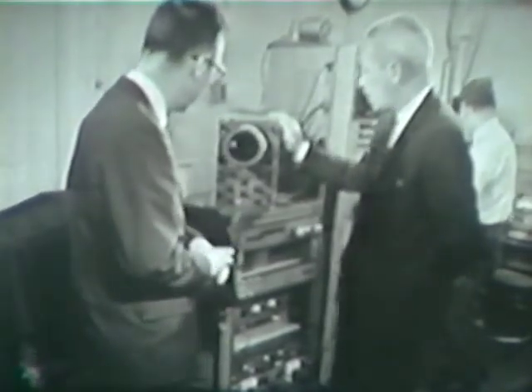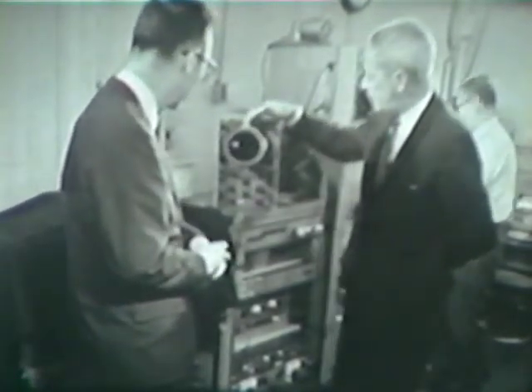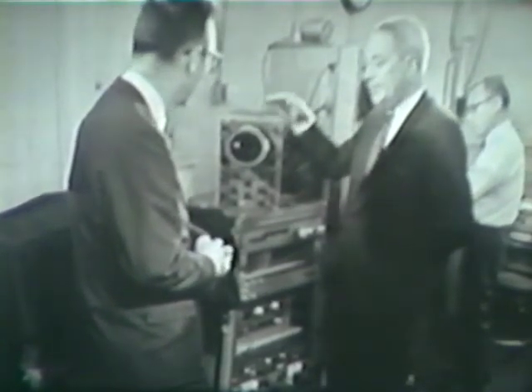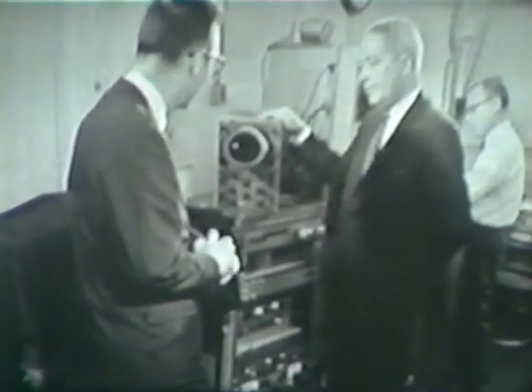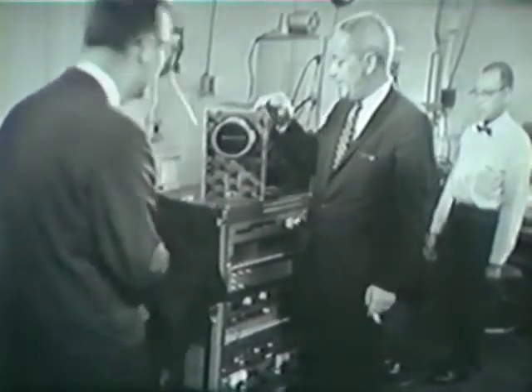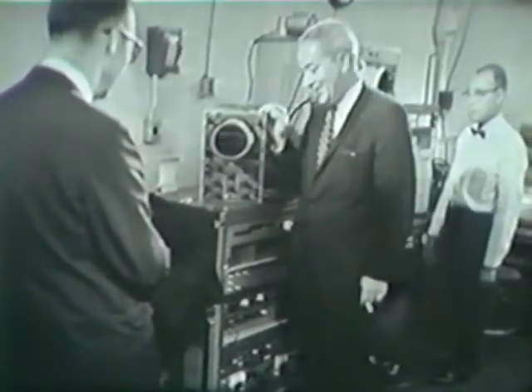Now what will we be seeing? The first thing we'll see here is just a sort of a TV display of the particular word that's on the scanner. Yes, I can see the word. The spot is moving across the whole field there, just the way it does on your TV set. But what we want is to tell what shape the letter is. So this isn't very useful, is it? This particular information doesn't do us much good.